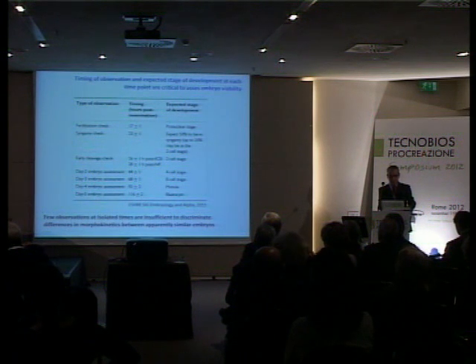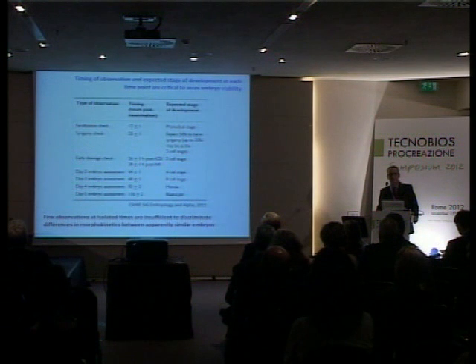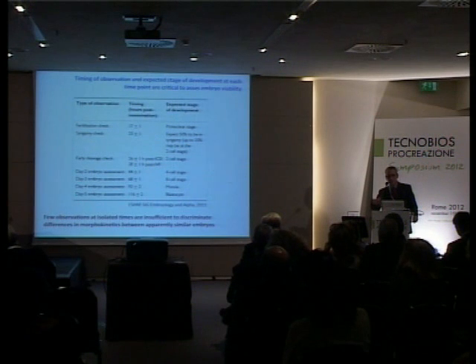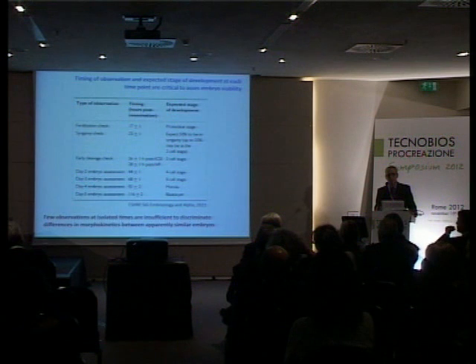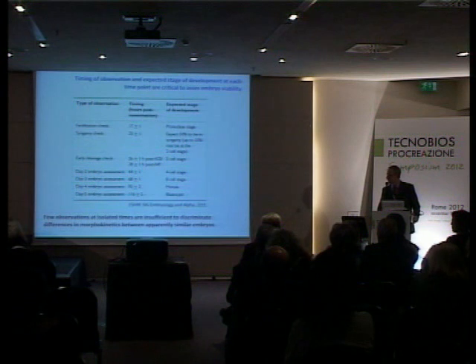So, there was a missing lecture this afternoon that would have covered the consensus about embryo morphology and embryo evaluation. But it is well founded that if we want to better define embryo quality and improve our selection ability, we need to observe embryos at a specific time and correlate those times with the expected developmental stage.